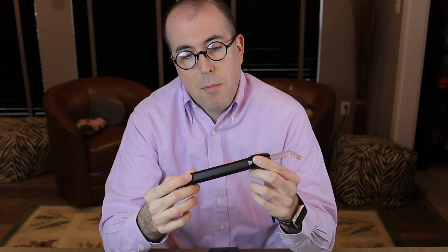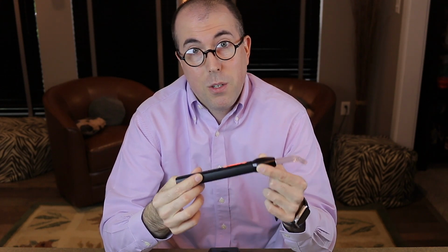But if I'm curing bonding agent, I need to get the composite in there, and that 3 seconds just cost me the ability to do that. That's a pretty big flaw. What I'd like to see is them make a motion sensor inside, so that when it's picked up, it turns on. So it detects that it's been picked up, and then it would be booted by the time it got to my hands. That would be the best.